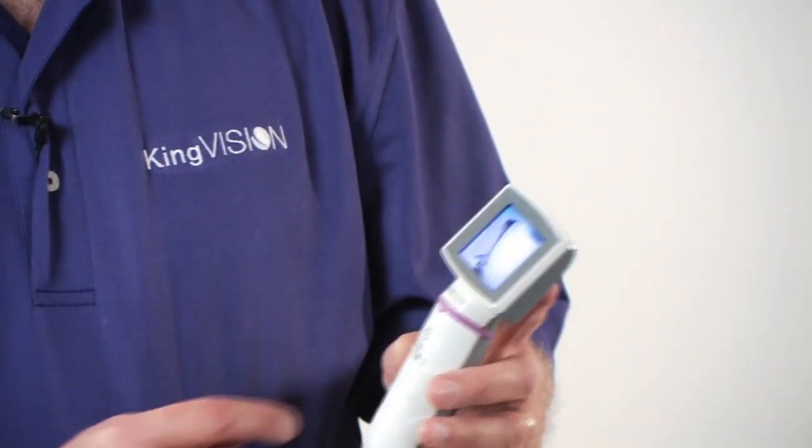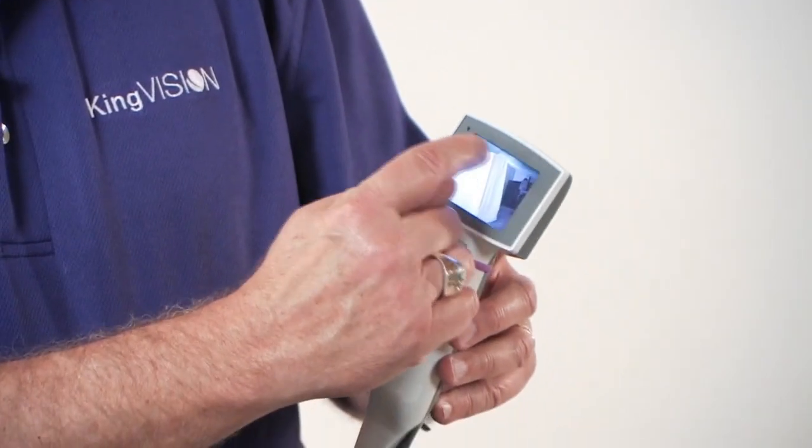The underside of the blade is actually visible on the screen, and this is an intentional design so there's no blind spot, and so there's a landmark as to where you're placing the tip of the blade.